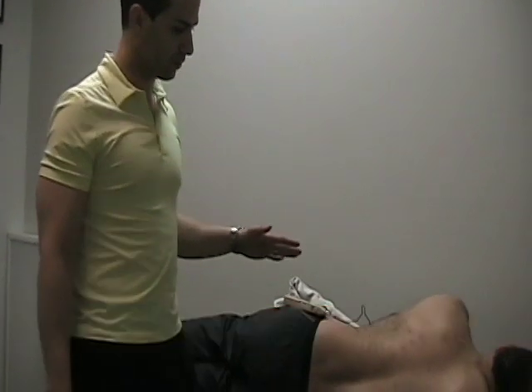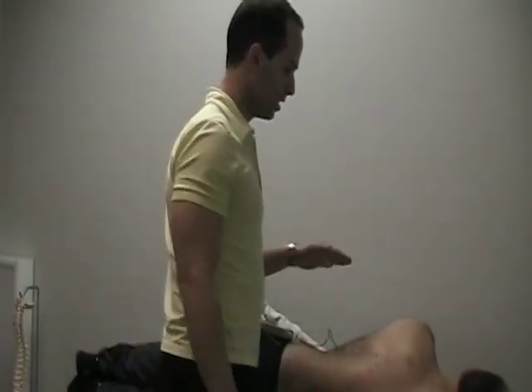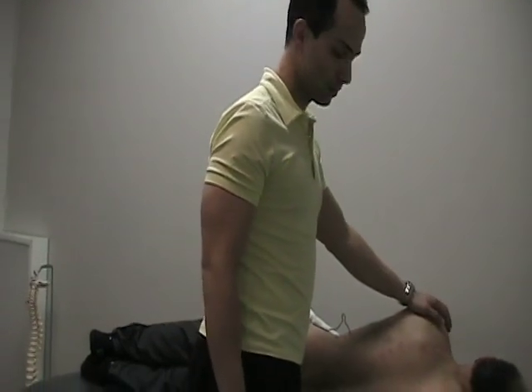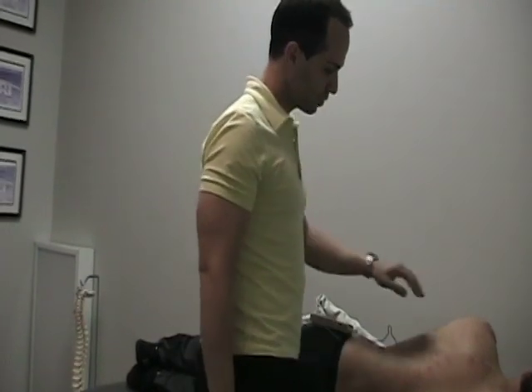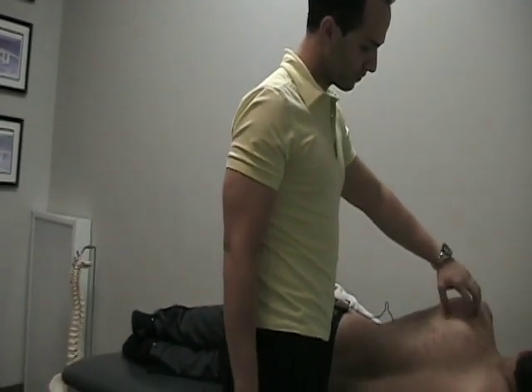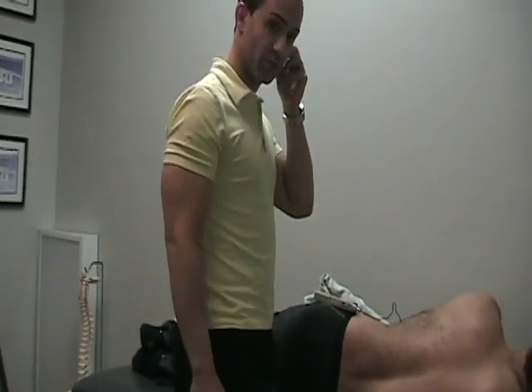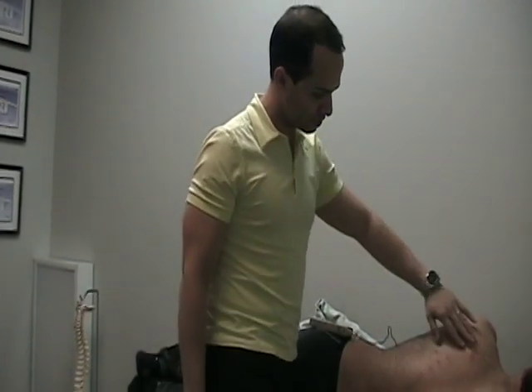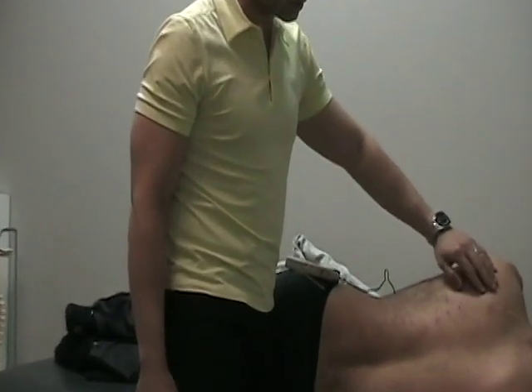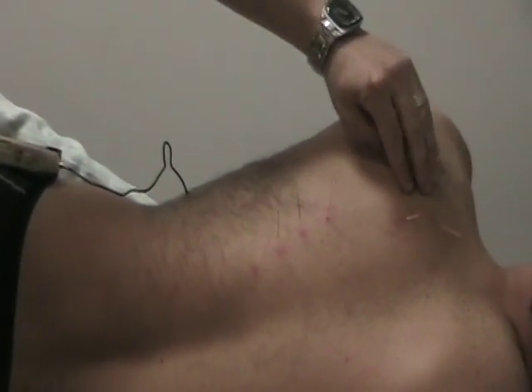Here we have a case with a golfer who is having trouble with scapular stability, which is leading to some posterior or superior glenohumeral shoulder joint impingement. We've already done some treatment which included active release of all the scar tissue in the rotator cuff muscles, and now we're on to the activation rehab stage. I'm using acupuncture needles to stimulate the nervous system — specifically the nerves serving the major scapular stability muscles.